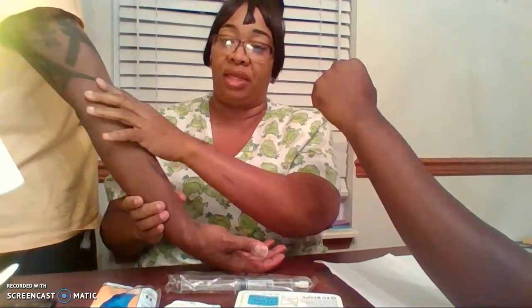You're going to palpate the vein for the sponginess, and you're going to locate a vein that would be optimal for the kind of medication that you're going to use. If it's just for fluid replacement, you can use these here in the hand. There are some in the wrist, but if you need something that is bigger for the bigger gauge needles, you're going to try and access something here in the antecubital.